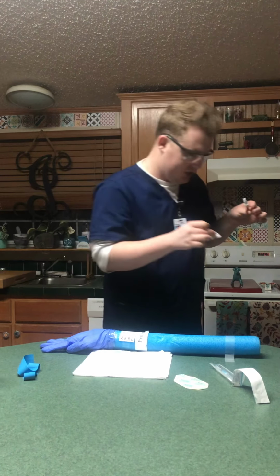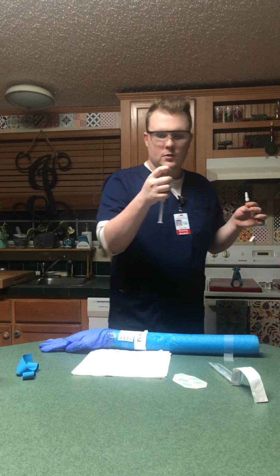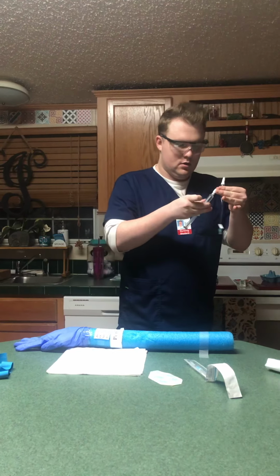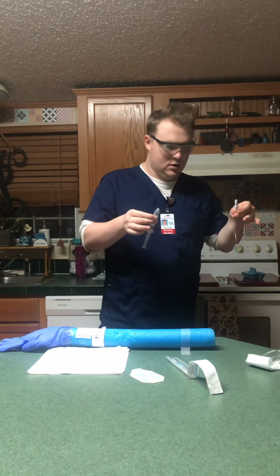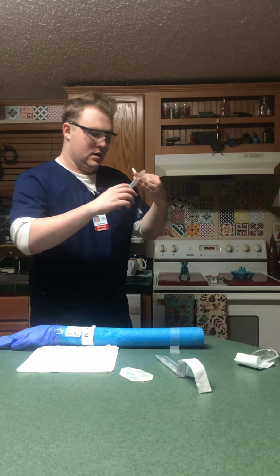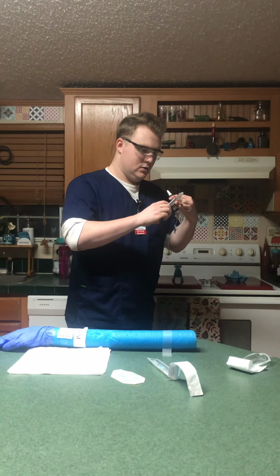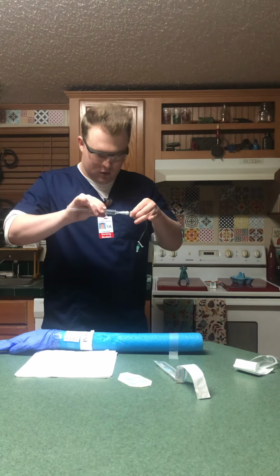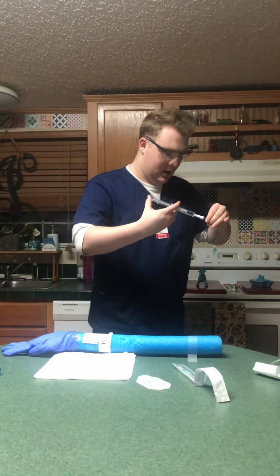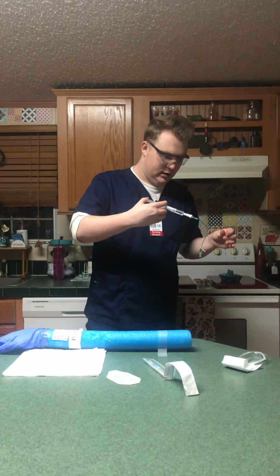Okay, so I'm swabbing the injection cap. I'm going to dispose of this in the trash. I'm going to hold this in the air, grab my 10 milliliter syringe, and using sterile technique, I'm going to open the cap and drop, and then I am going to pull back slightly and then flush. Okay, and connect the two. Once they're connected, I'm going to flush ever so slightly.